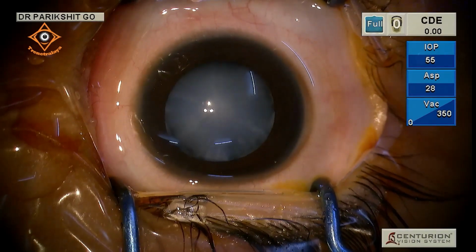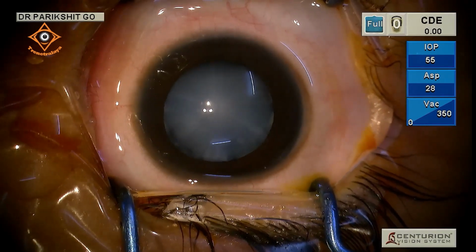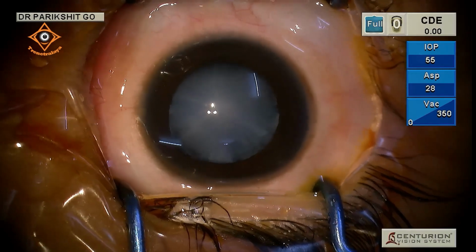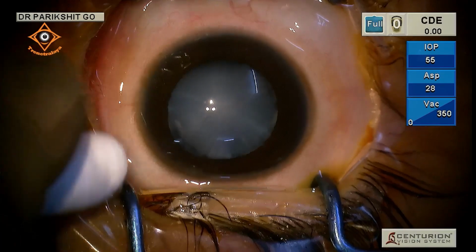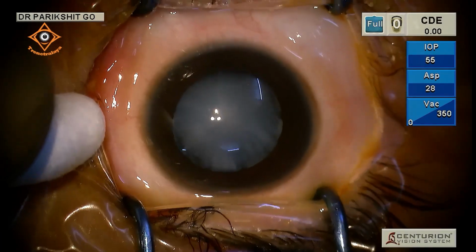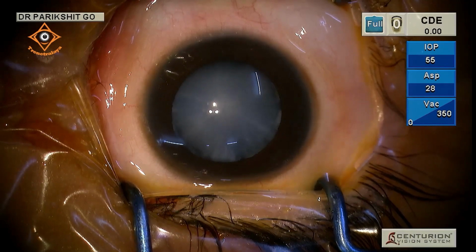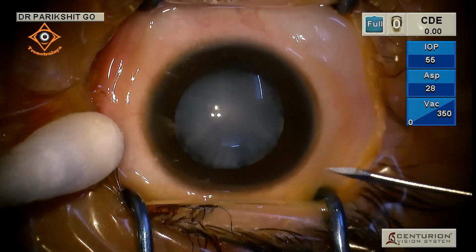Yeah, no. I think I can, sir. What we have done is we have given this child a small block. There is Dr. Bhattacharji here, who is the senior anesthetist, and we have intubated the child, and sevoflurane anesthesia is being given. But even after giving excellent intubation anesthesia, I have also given a 1 cc block, so that when this child comes out of anesthesia, for about 60 to 75 minutes there will be some block and there will be less pain.